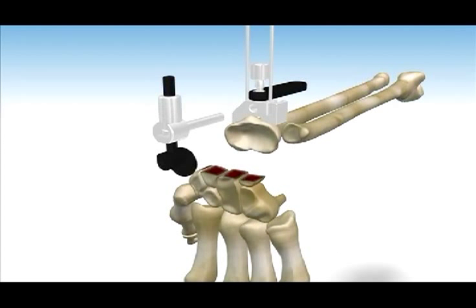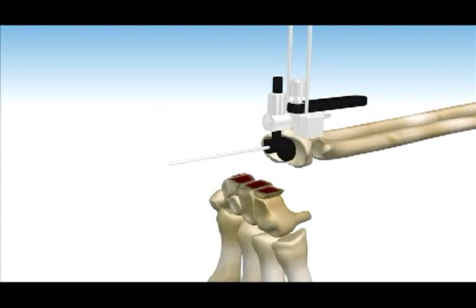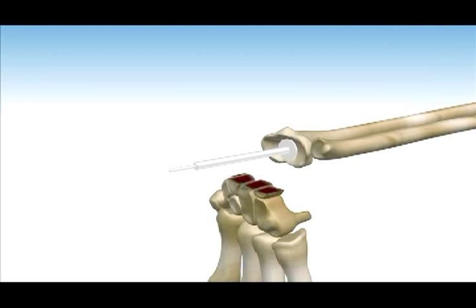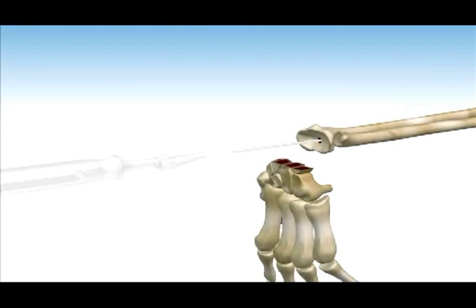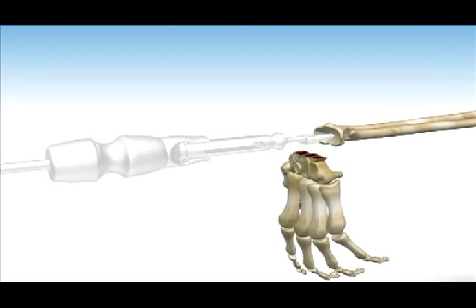Insert the PGT radial pilot template into the PGT guide. The radial pilot template should sit firmly against the prepared surface of the distal radius. The radial pilot template may be adjusted dorsal and palmarly to achieve correct dorsal palmar alignment. Place the 2 mm guide pin into the radius. Remove the template. Confirm the position of the guide pin with imaging, biplanar x-rays. The cannulated PGT radial counterbore drill is used to create a pilot hole for broaching. Broach the distal radius over the guide pin. Broach to the correct size of the radial implant which is determined from preoperative templating and size match at time of surgery.